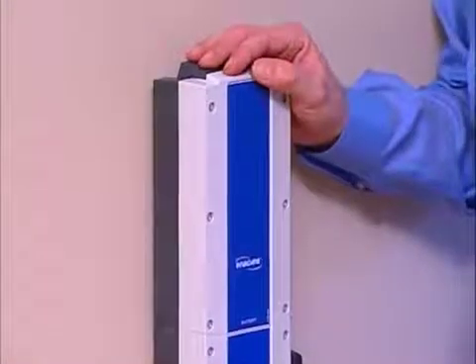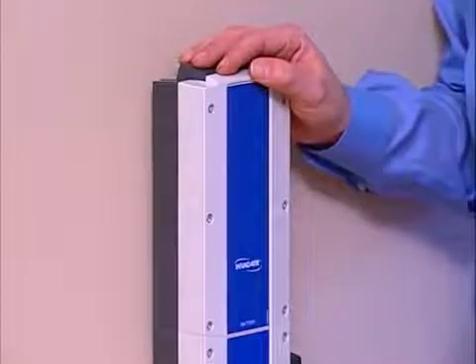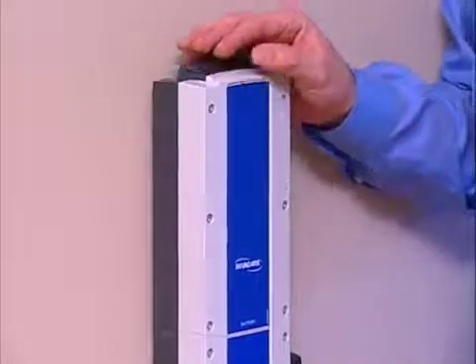It's recommended that you leave the battery on the charger until you need to use it. The charger will trickle charge the battery to make sure that it's always at full capacity. And daily charging will prolong the life of the batteries.